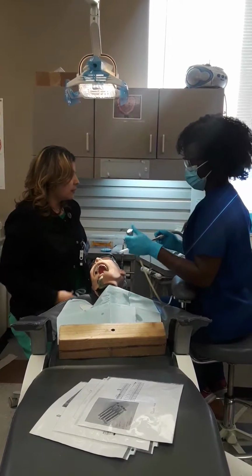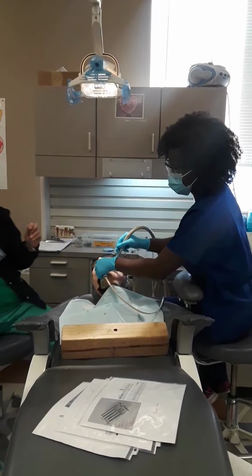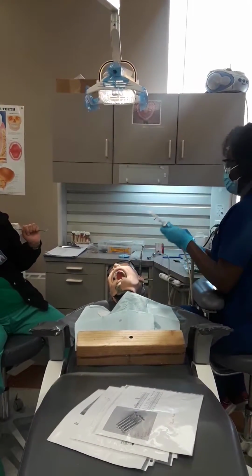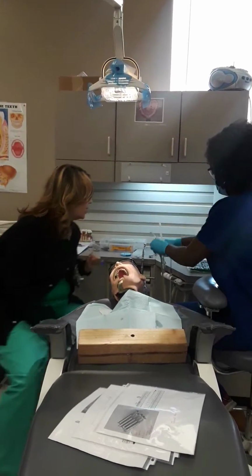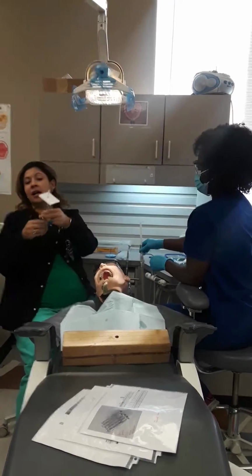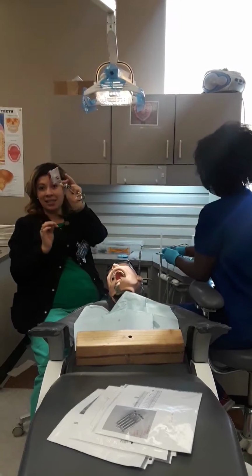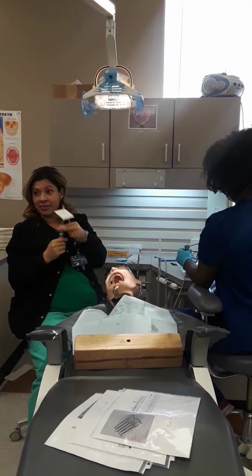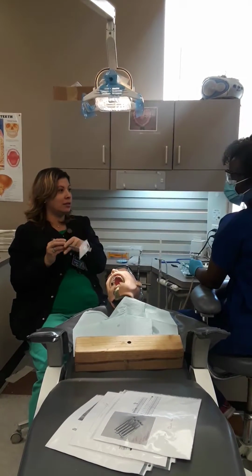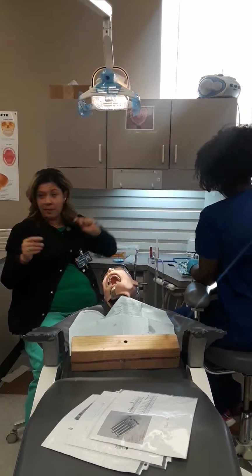So you know what to do. She's going to give a full mouth rinse, and we are on what step number? They're going on the side, so that's what they're reading. Okay, so she did a full mouth rinse, because if you guys want to taste this, once you take this out and you're over there, if you want to taste this, this is gross. I don't even know what to say it tastes like. It tastes like nasty water. Very bitter, nasty water, so that's why we rinse our patient.